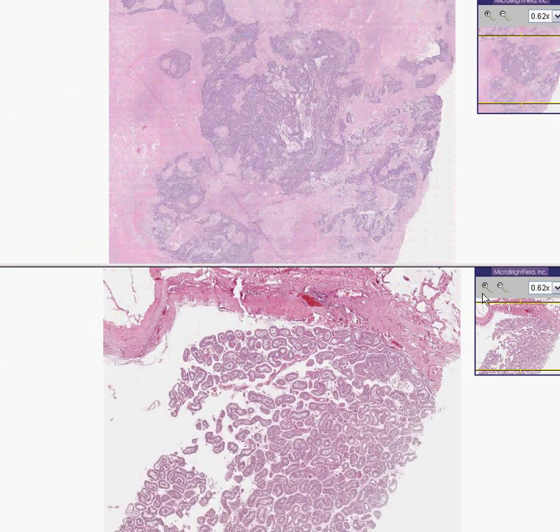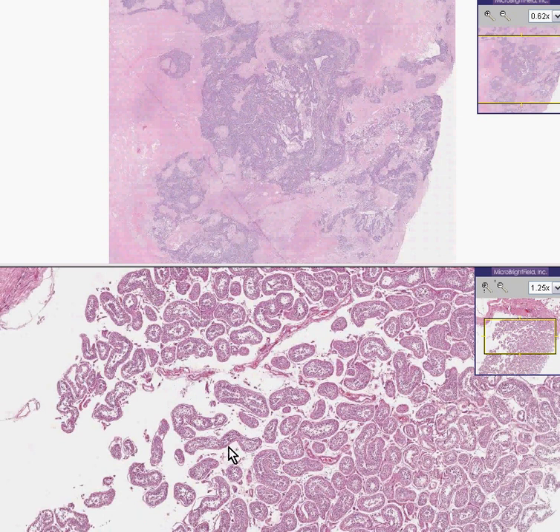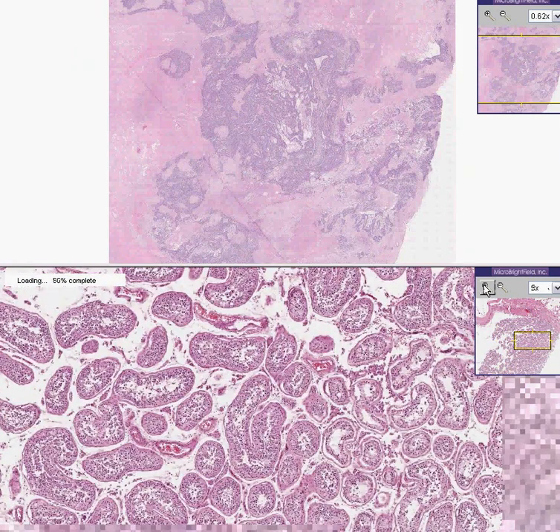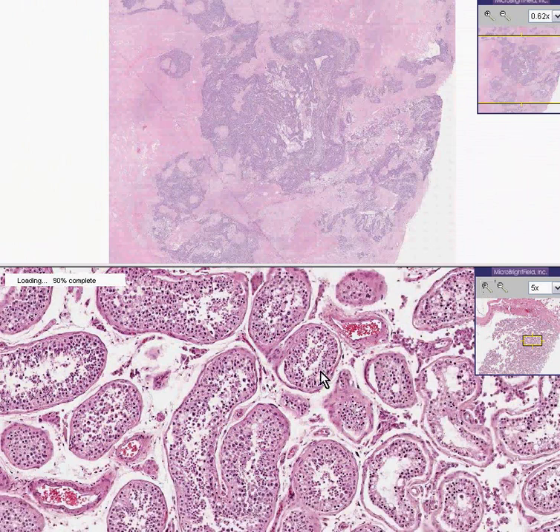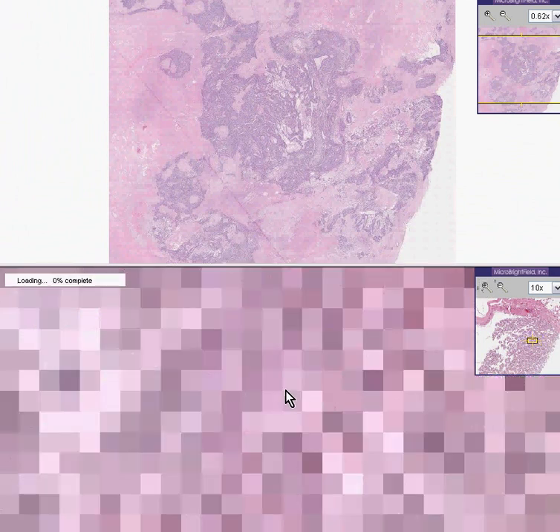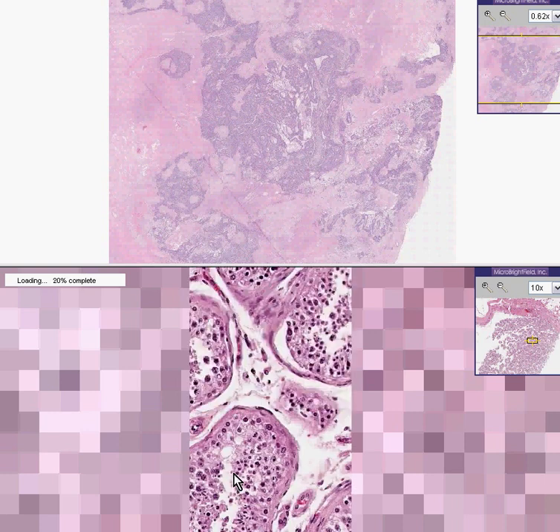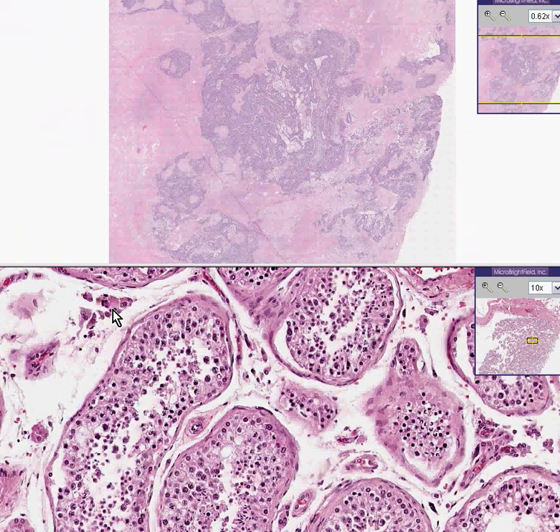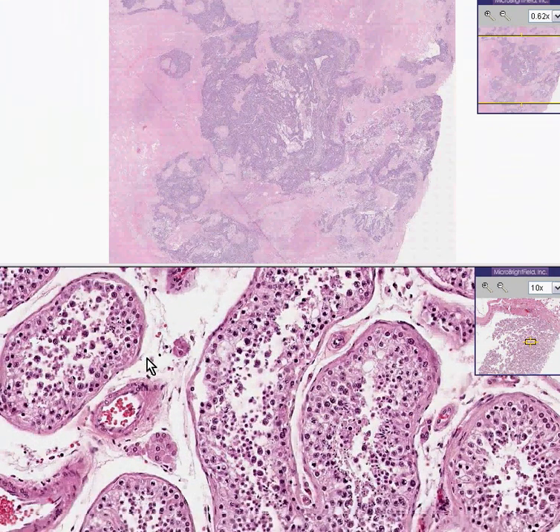The structure on the bottom is a normal testis. You can see a nice capsule here and the seminiferous tubules. Even at this stage, if you zoom in, you can see the maturation from the outside of the tubule — from the primary and secondary spermatocytes all the way into the spermatids and mature sperm seen in the lumen. Every now and then you may see some orange cells between the tubules, which are the interstitial cells of Leydig within the interstitium of the testis.